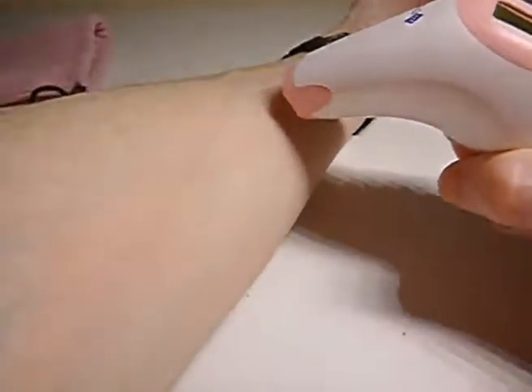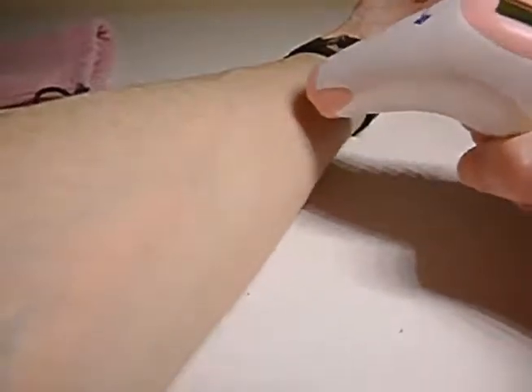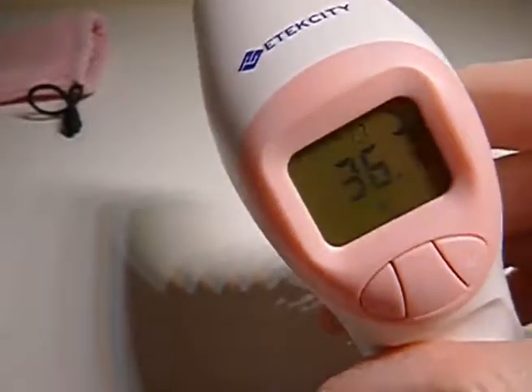This is just measuring the temperature on my arm, just purely to demonstrate how it works and how to use it. Just run it along the arm or where it is to be measured, and the temperature of my arm is 36.7 degrees. I'll try it on my forehead.